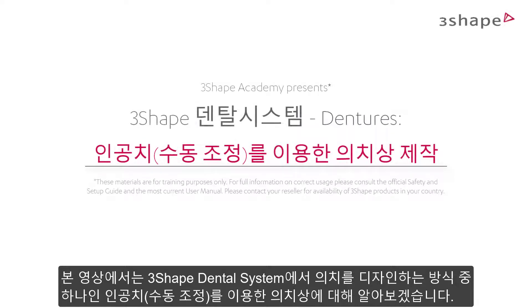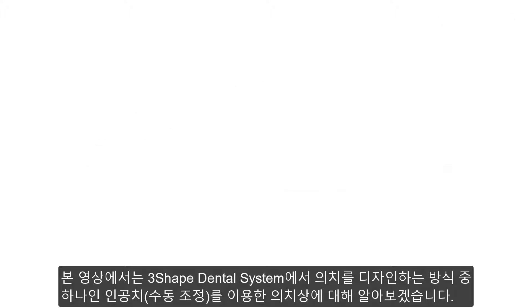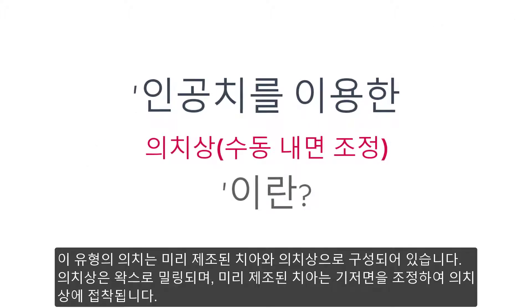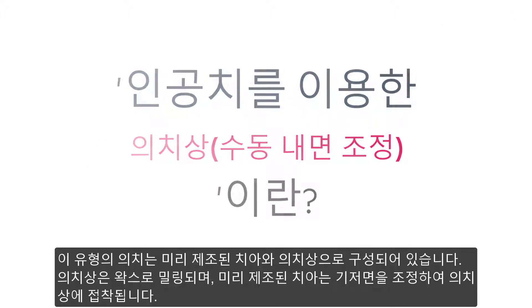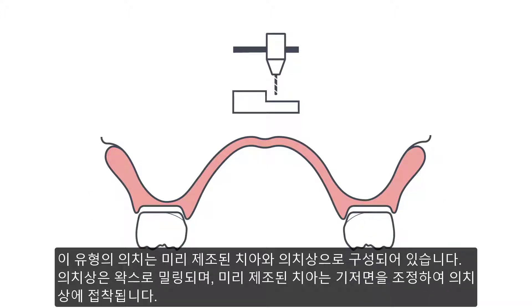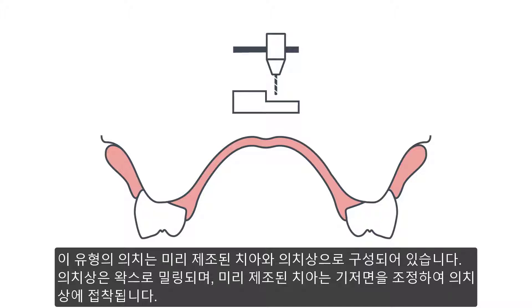In this video, we will introduce you to the base with artificial teeth, manual reduction, which is one of the assembling types when designing dentures in the 3-shaped dental system. This is a type of denture that consists of a base with pre-manufactured teeth. The base is milled from wax, and the pre-manufactured teeth are glued into the denture base after manual adaptation of the teeth's basal surfaces.